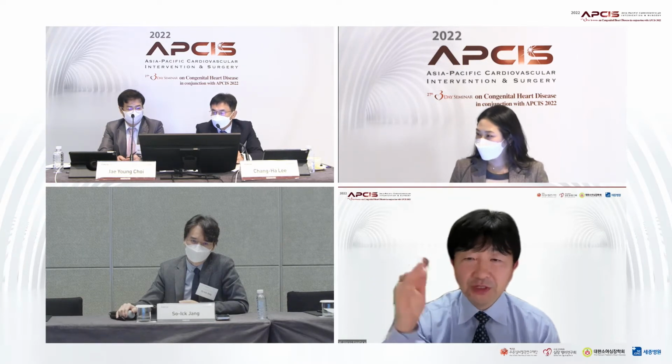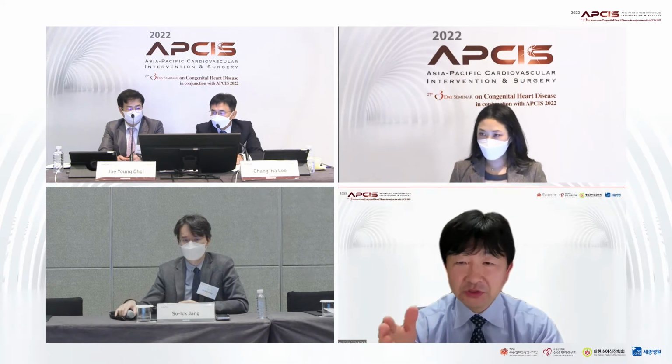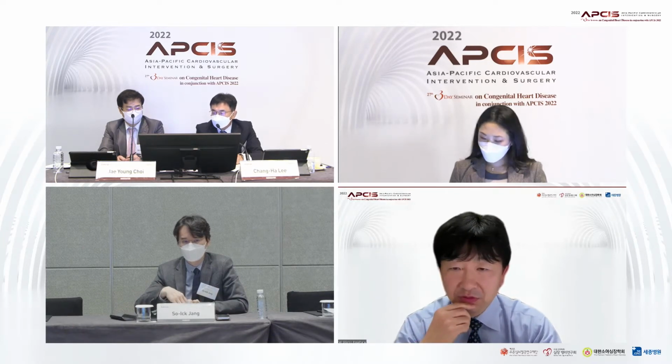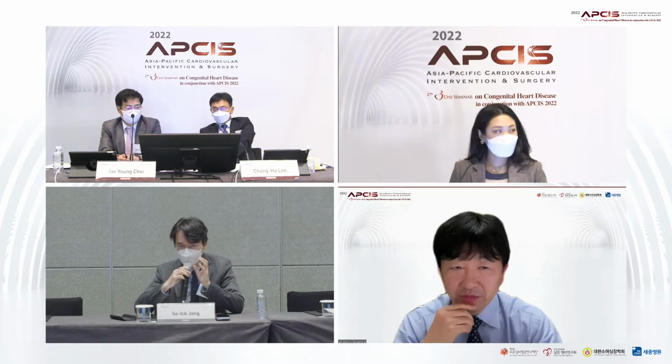I mean the left side stent is a little bit protruding into the main pulmonary artery. The concern is about some flow turbulence in the left pulmonary artery, or some tissue inside the pulmonary artery. Actually, the stent is in a slightly distal portion, not a protrusion into the MPA. Right, the mid LPA position.